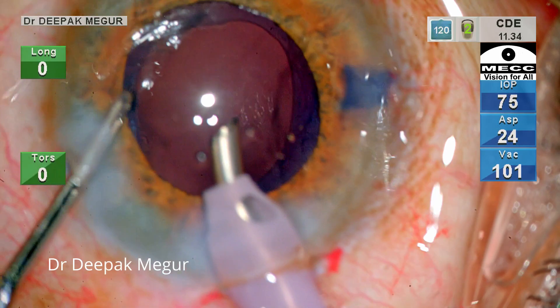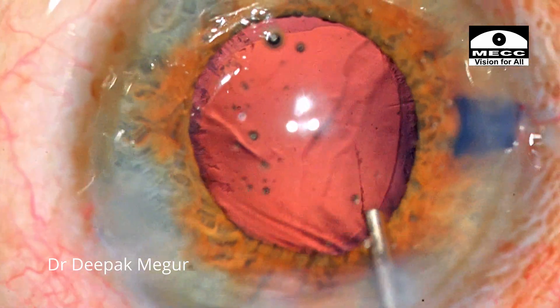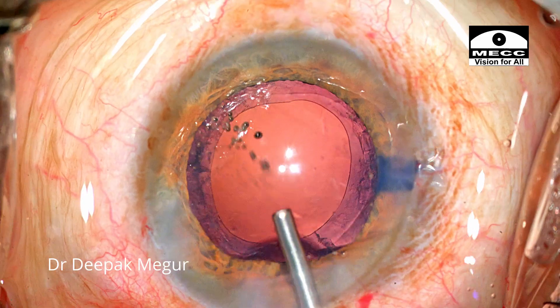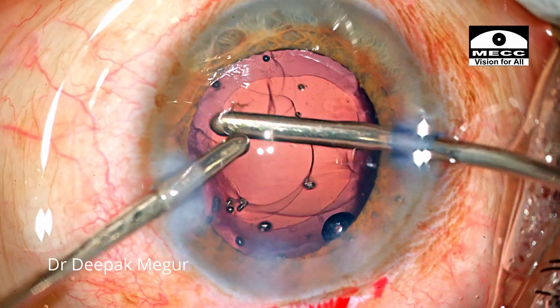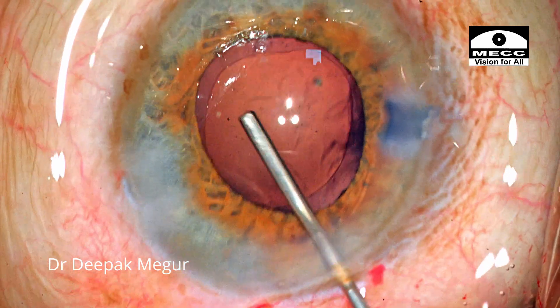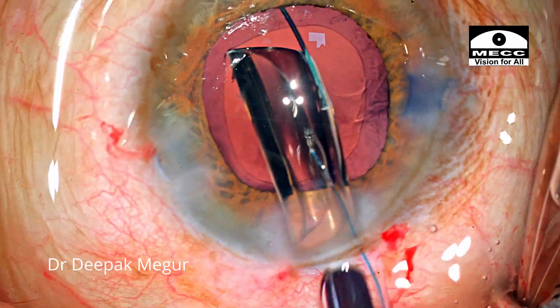A small fiber was tucking in the side port which is also removed. A little bit of cortex is remaining. The capsule is flushed with BSS just to separate the fibers clinging onto the posterior capsule, and then the cortex is removed. Using bimanual irrigation aspiration, the cortex is aspirated out. Following which the capsular bag is formed with viscoelastic and then an intraocular lens is placed into the bag.